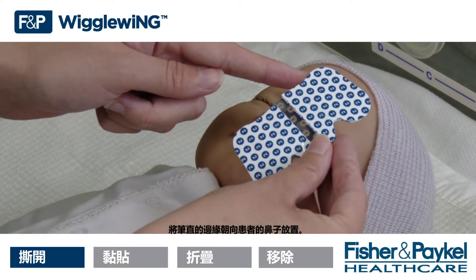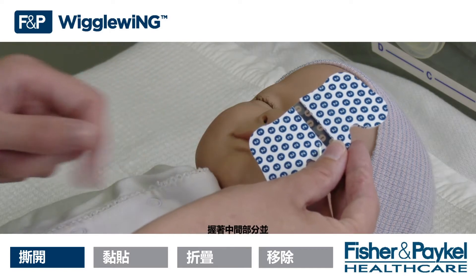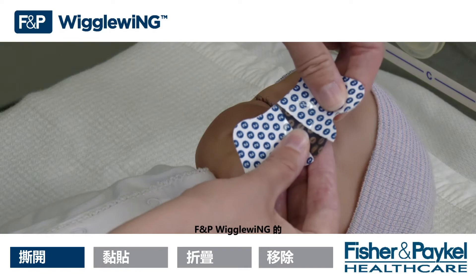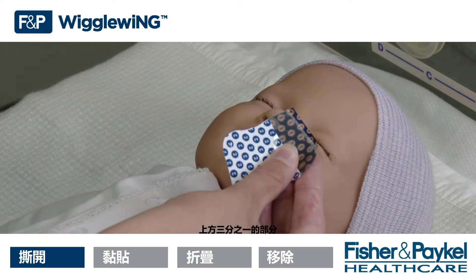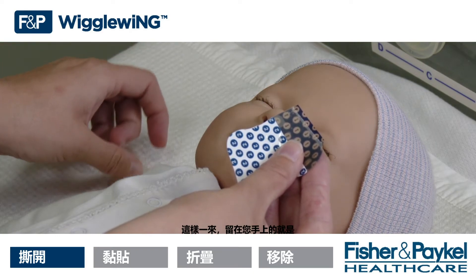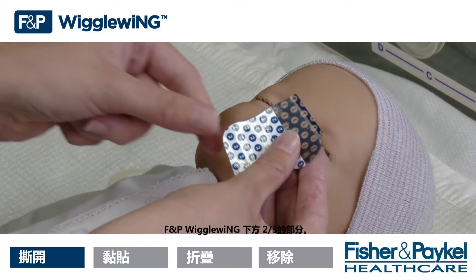Place the straighter edge towards the patient's nose. Rip off the entire upper third of the FMP Wiggle Wing distal to the patient's chin by holding the middle section and ripping off the upper section. This will leave you with the lower two-thirds of the FMP Wiggle Wing.